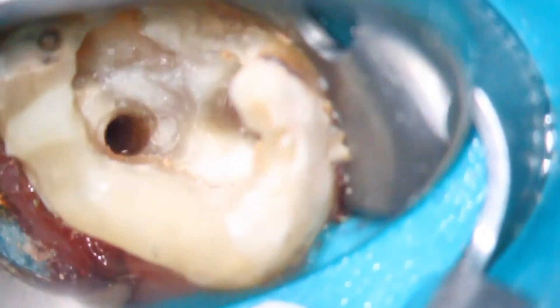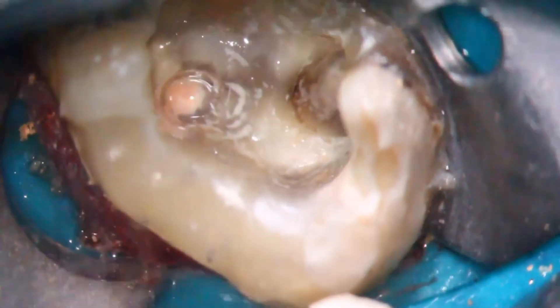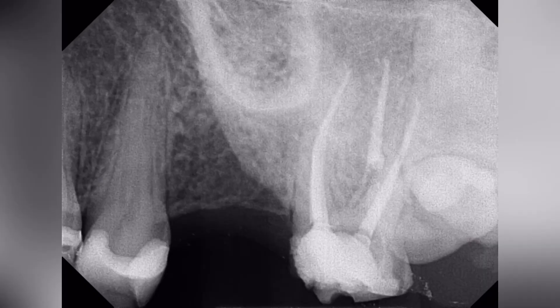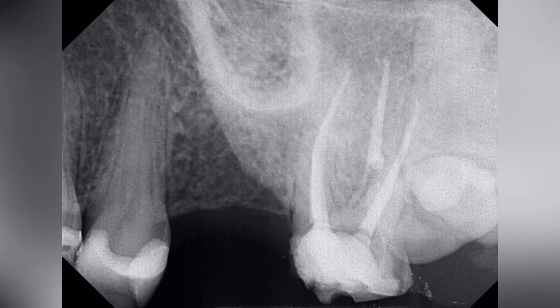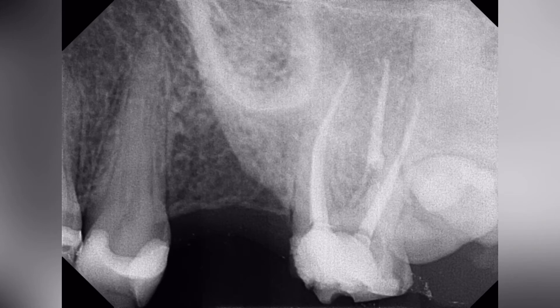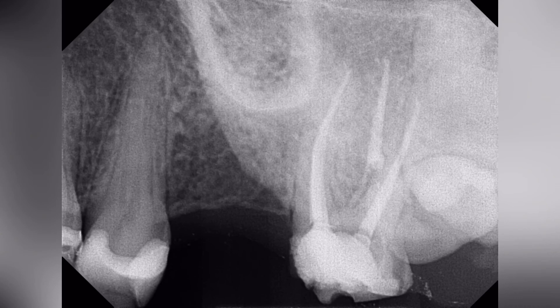We were able to trough and find an extra root, MB2. Then we did the root canal filling, and then the obturation, and then the final seal. We successfully achieved the retreatment objectives and are thrilled for the outcome for the patient.